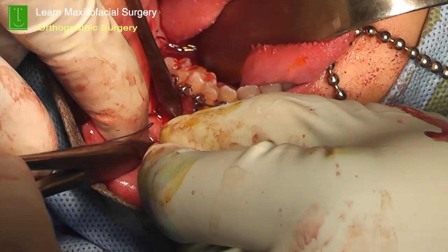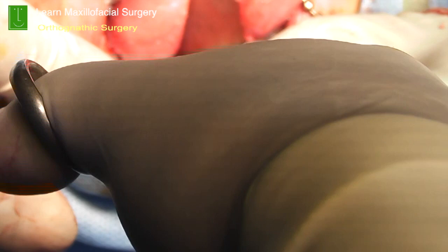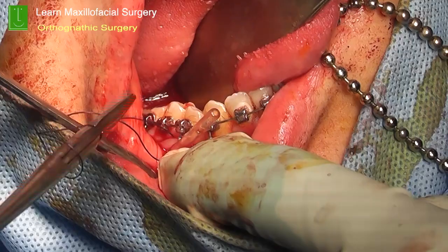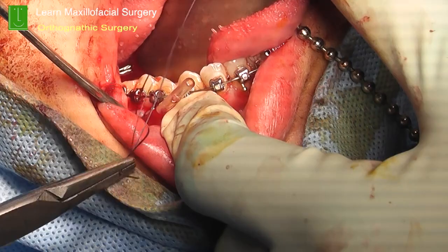Just a simple tube is good enough for drainage, and that's usually taken out after about 24 to 48 hours once the swelling on the right side or left side of the cheek has come down. Three-zero Vicryl is pretty good on an atraumatic needle, causing the least amount of trauma to the soft tissues. That's the suturing on one side.